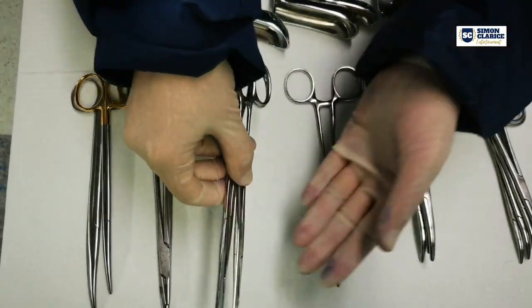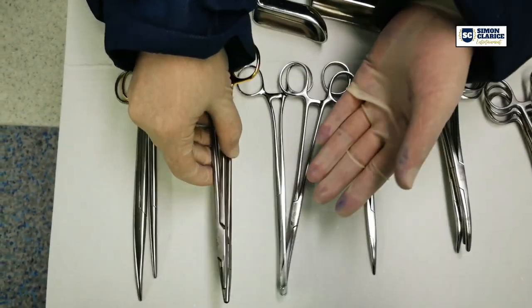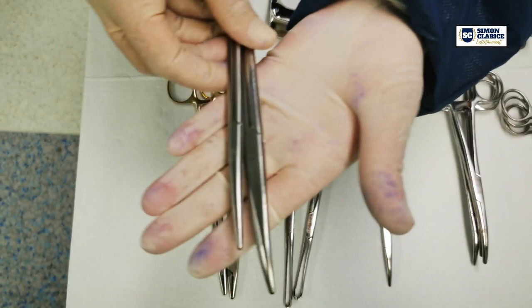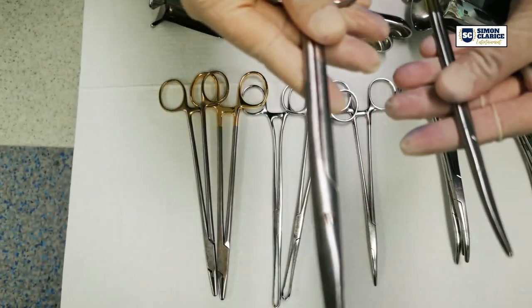Two long Allis forceps. Two needle holders. Two scissors — a Metzenbaum and a Mayo scissor.